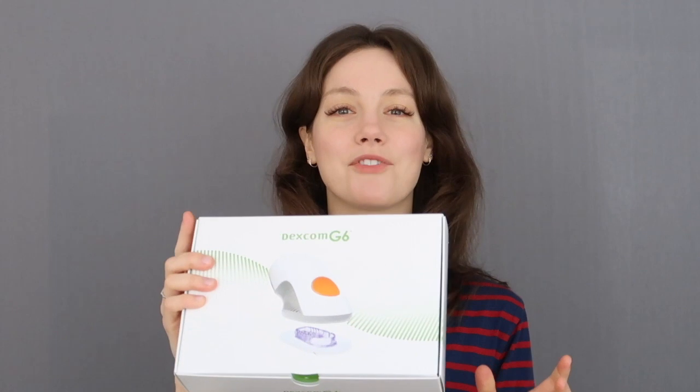So this is the Dexcom G6. It is the newest iteration of Dexcom CGMs and it is no calibration needed, no finger sticks at all needed. Which is obviously incredibly exciting and I'm really excited to start using it.